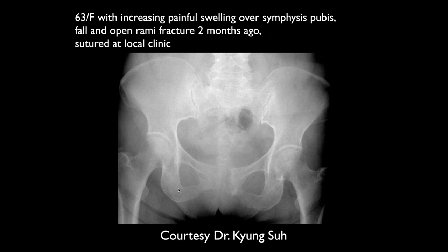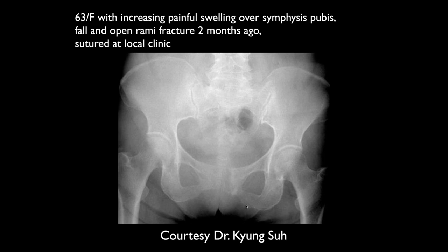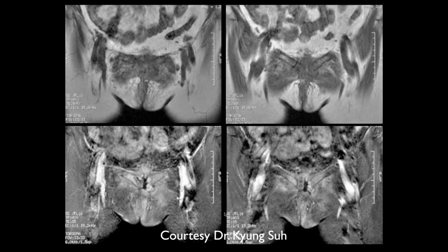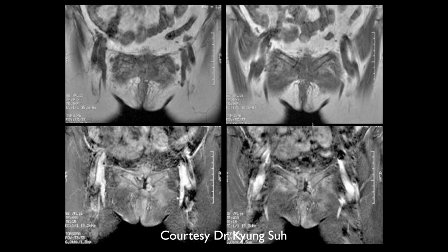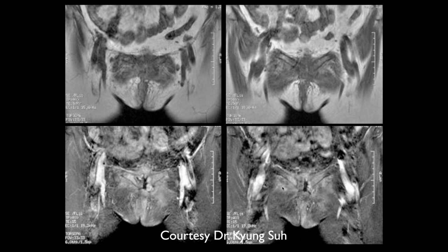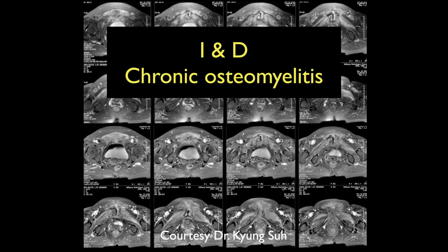A 63-year-old female with increasing painful swelling over the pubic symphysis following an open rami fracture two months ago repaired at a local clinic. On X-ray there is lucency involving the pubic symphysis and irregularity of the inferior pubic rami bilaterally. On MRI, diffusely low T1 and increased T2 signal involving the pubic symphysis is consistent with osteomyelitis following suture repair, with adductor muscle edema bilaterally.